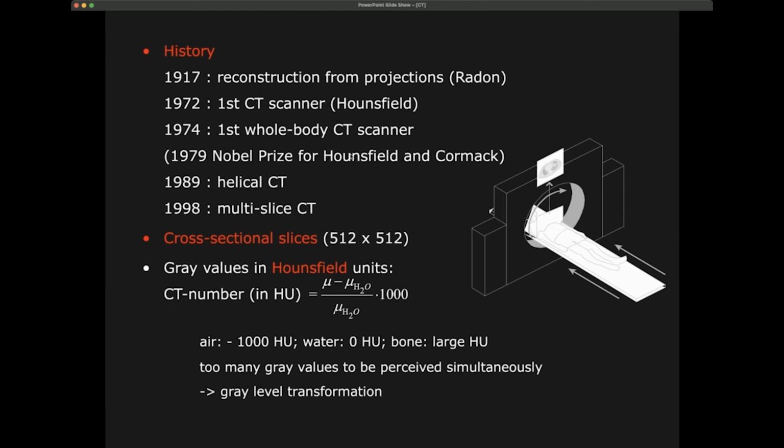It's very difficult to look at detailed morphology that way, so the CT scanner was a big step forward. And over the years, and it's still going on, the CT scanners have been evolving, getting bigger in part and better in resolution, and predominantly faster, and especially also with less radiation, because we still have to use X-rays, so there's still the problem of the damage that you do using ionizing radiation.